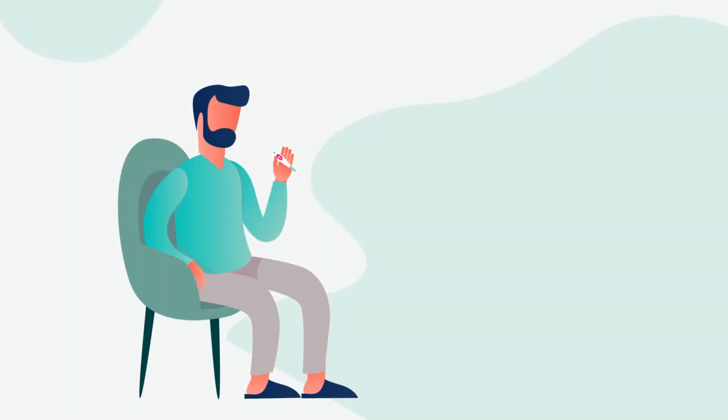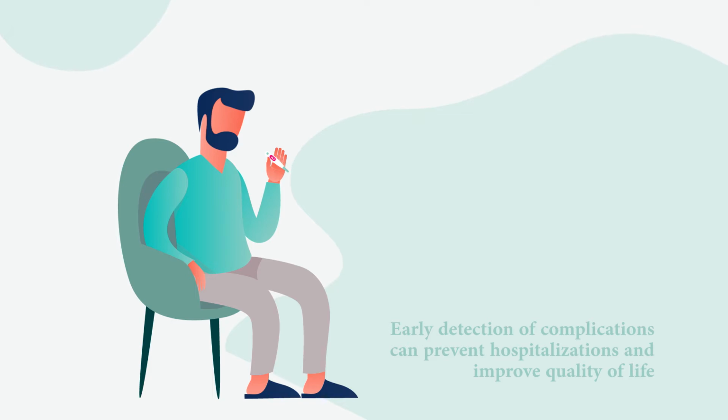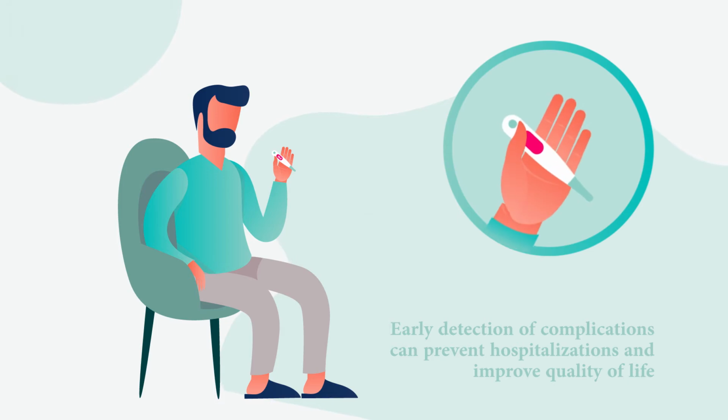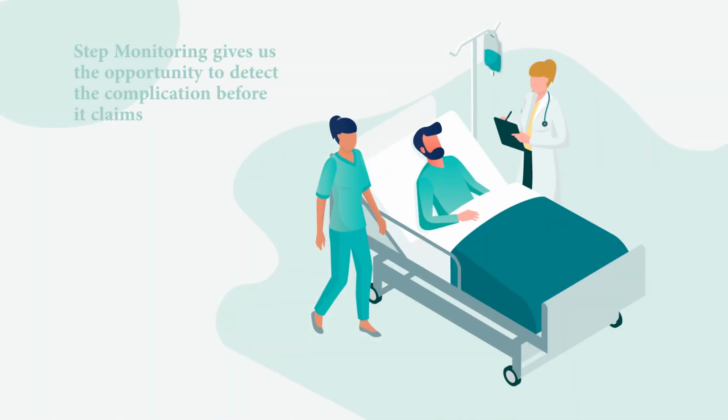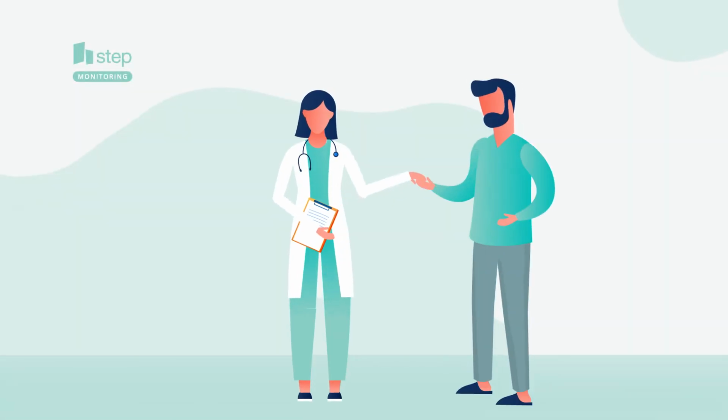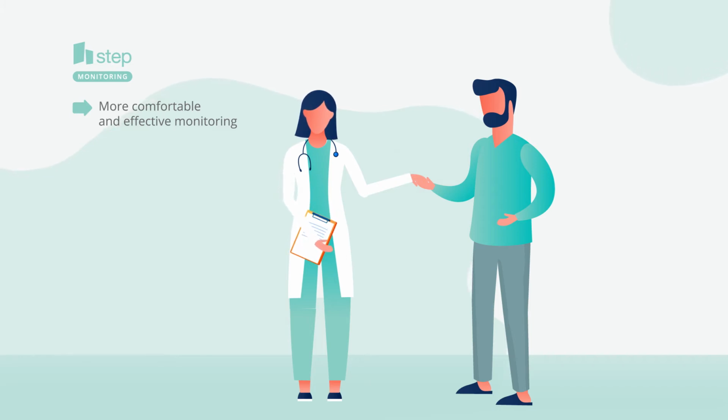Imagine the specific case of a severe infection that could have been detected sooner had the patient simply alerted us the moment they had started to feel feverish. This circumstance can lead to the patient's admission to the hospital and even the interruption of treatment to stop the infection, with the negative consequences that this may have in the evolution of their cancer. With STEP monitoring, not only are we going to do follow-up more comfortably, but we're going to be able to improve the prognosis and results of patients. And very importantly for us, they will find themselves as well as possible throughout treatment.